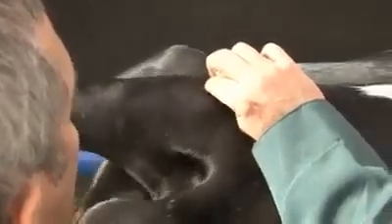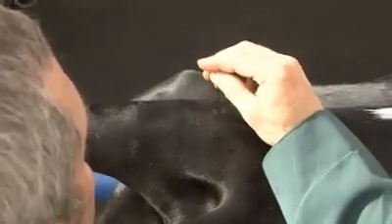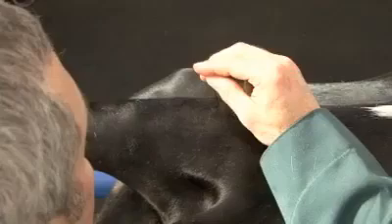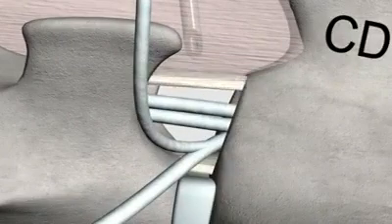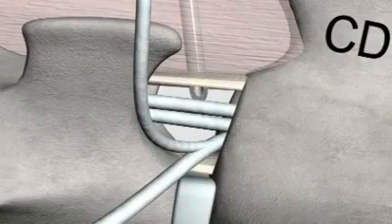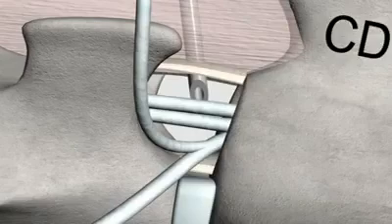Insert the needle on the dorsal midline, directly over the space at a slight caudal to rostral angle to the skin. Slowly advance the needle ventrally and on midline through the subcutaneous tissue and the ligament of the dorsal spinous process. As the needle penetrates the ligamentum flavum, you will feel a popping sensation and tissue resistance will disappear. You may also hear the faint sound of air rushing into the epidural space as the negative pressure is relieved and the epidural space expands.